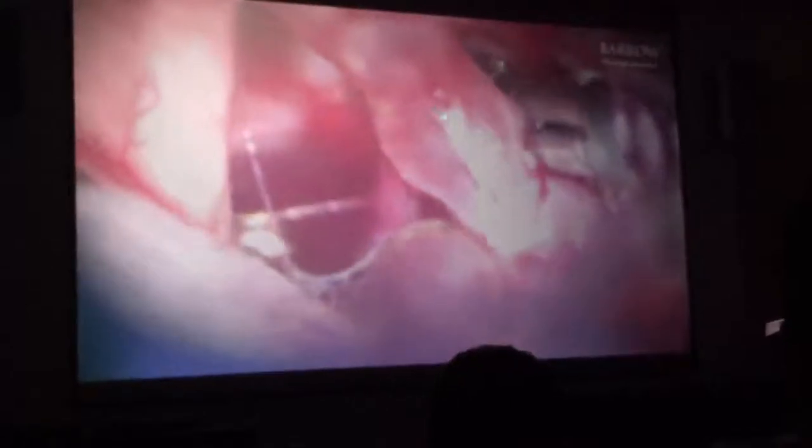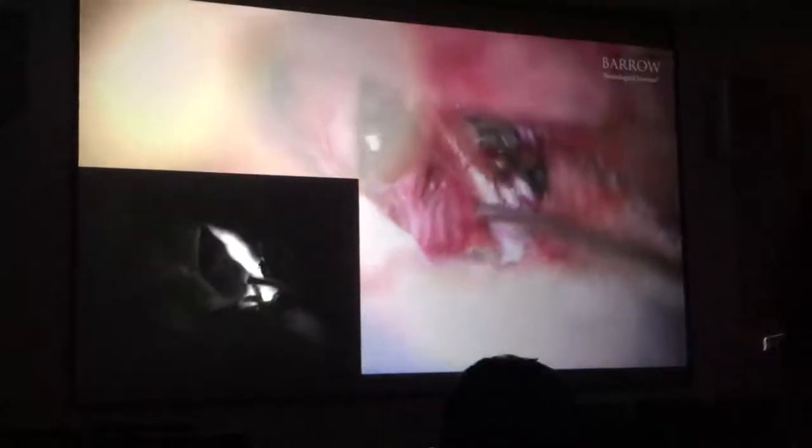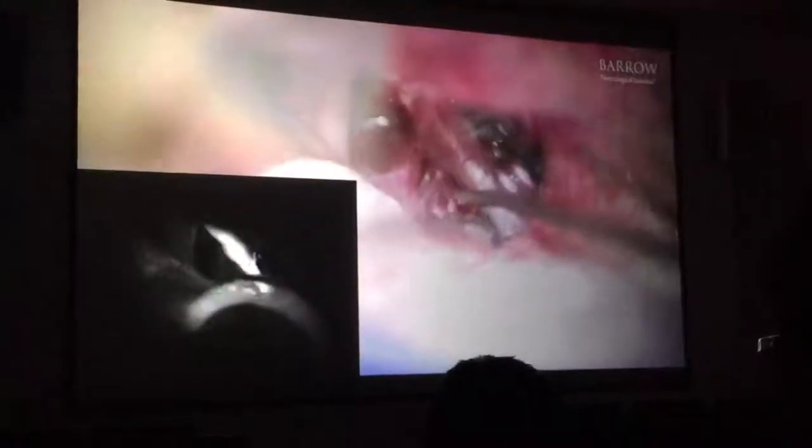And then we put a clip down, taking off the temporaries. Now we have a clip. There's a little bit of the neck here because we wanted to preserve the back of the artery for the PCOM, and we've done that. Now it's occluded, and now we can go ahead and include the anterior choroidal artery aneurysm. The key there is naturally you've got to be absolutely certain that the anterior choroidal artery is preserved, and we check that out. Right here is the anterior choroidal artery, and if you look at it you can see that it's filling very, very nicely. And that's really the key.